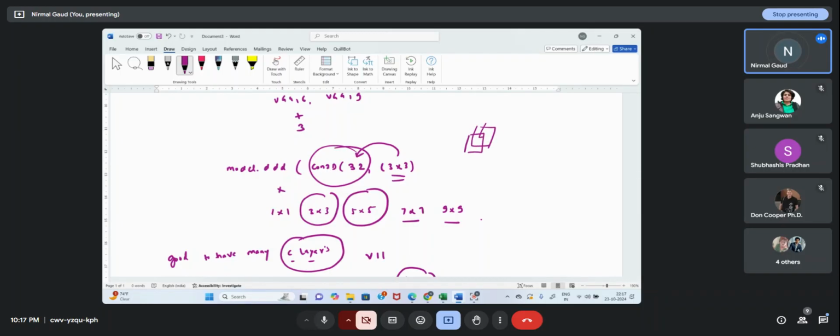This is how 32 convolutions are taken, all in parallel. And you have to give your image to the convolution. It will pass through all the filters, and then you are going to get a result.